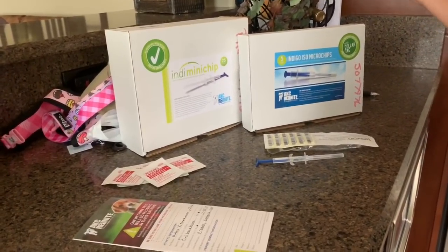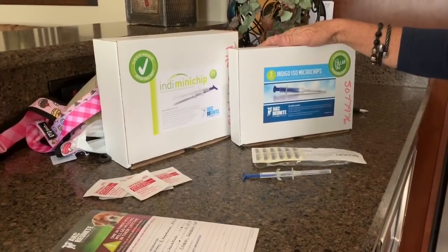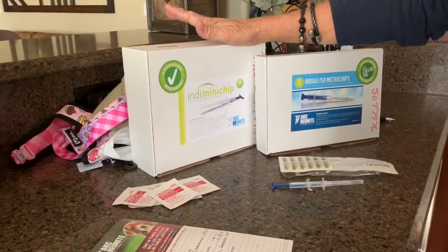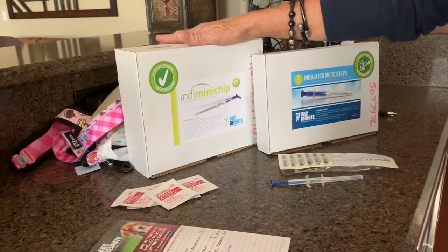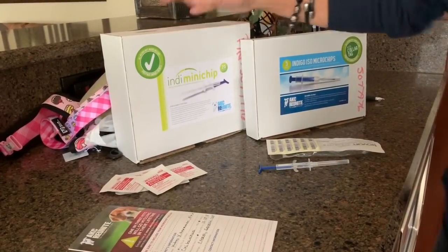We have two different types of microchips that we can use. We have the regular Indigo microchip — it's for larger breeds and extremely thick-coated dogs. But we use the Indy microchip, the mini microchip, for the Chihuahuas — all of them, long coat or smooth coat, it doesn't matter. It has a smaller antenna on it, so you don't want to use these on the larger breeds.